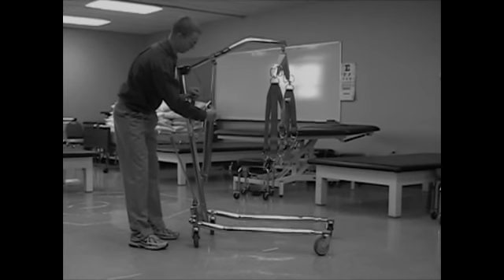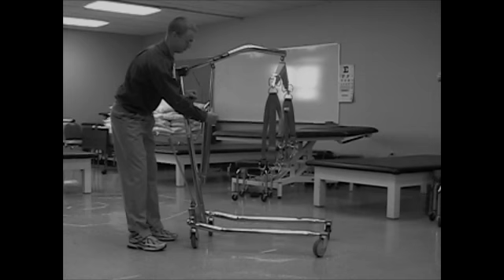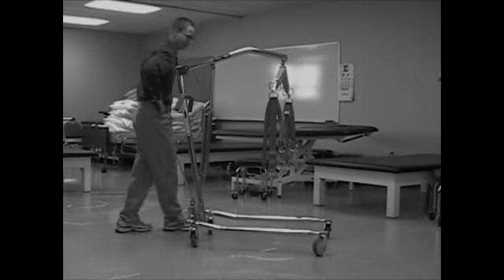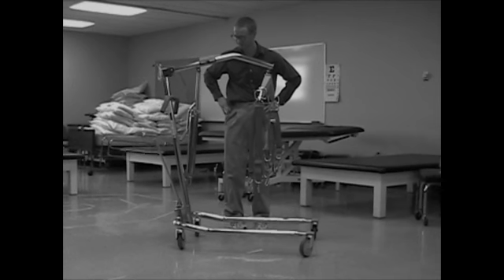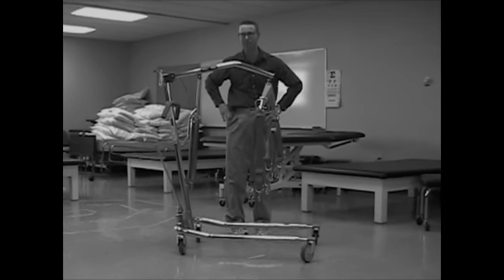You've just found the hydraulic release valve. This allows you to lower the patient with ease into the desired spot. So what do you think, Mr. Pomperbottom? Ready to give it a whirl?